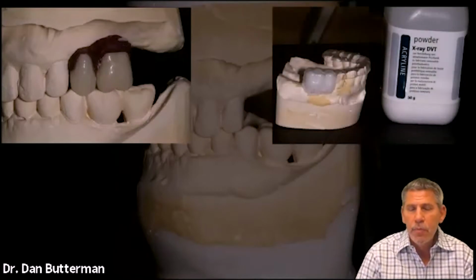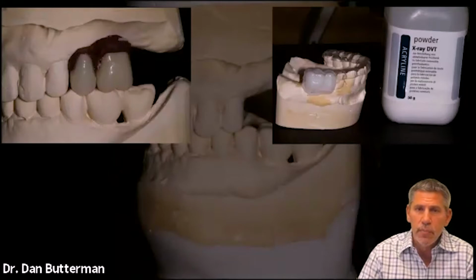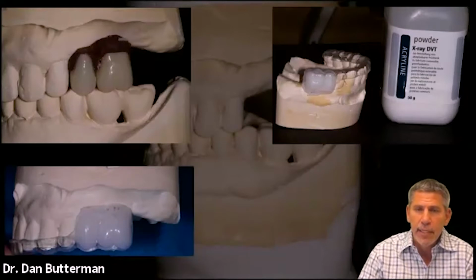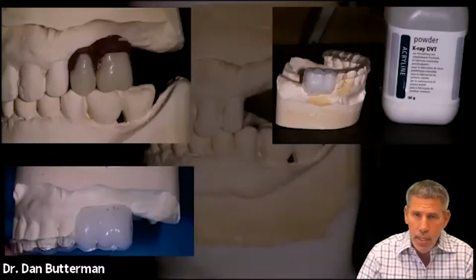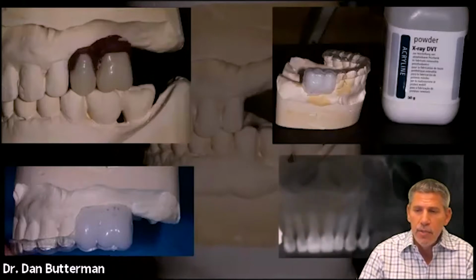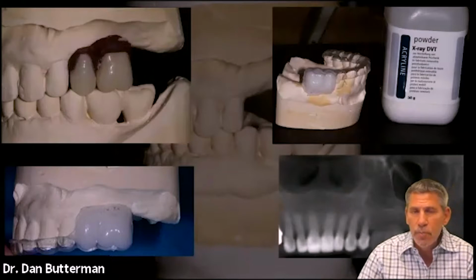Well, I need to be able to figure out where those teeth are in relation to the patient's bone, and we're going to be taking a CBCT. So then you would ask your laboratory to make some sort of a barium sulfate scanning appliance. So, okay, you send that to the lab and they take care of that. And again, it's going to be another couple weeks, maybe another couple $100 for you to do that. And then you can finally now take your x-ray. And now you can just start to plan after a month and a half has gone by.